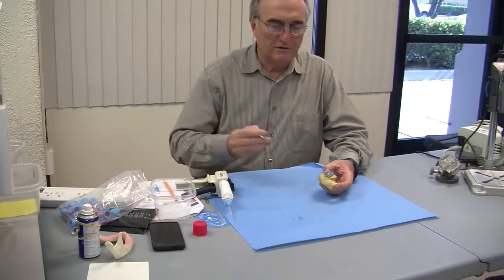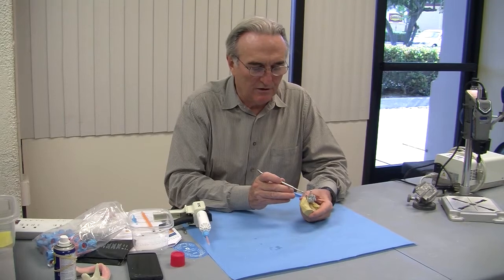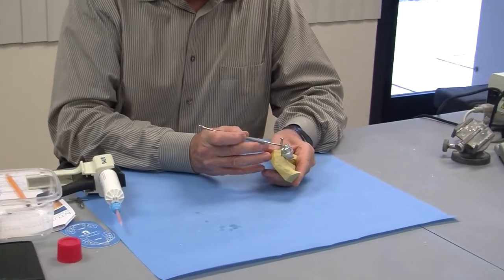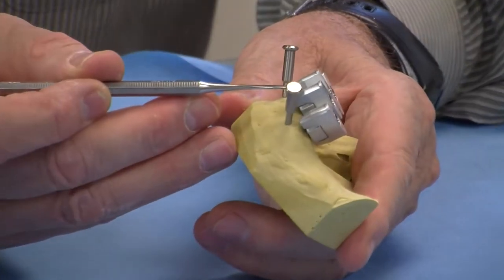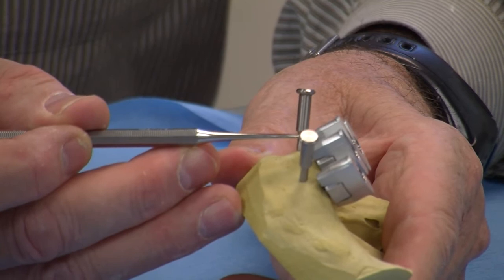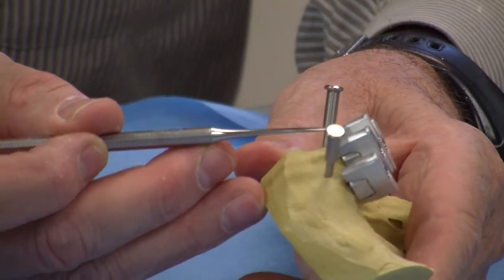We are going to use Luxatemp as a first layer of the guide. It is important to look at the tapering of the part of the guide holder pin and not overfill the Luxatemp beyond the slope of the part.